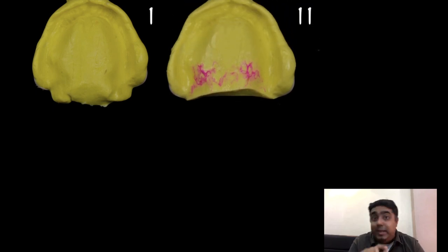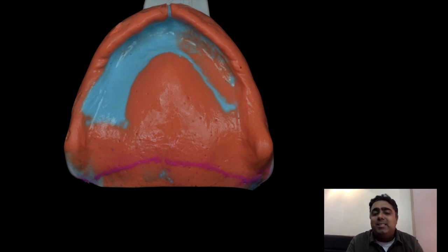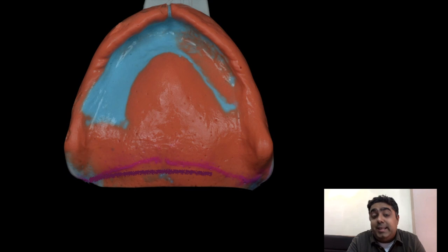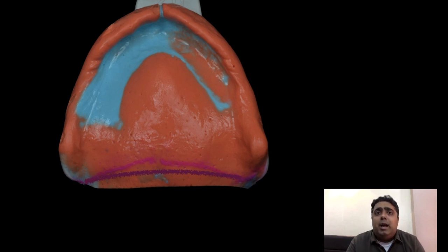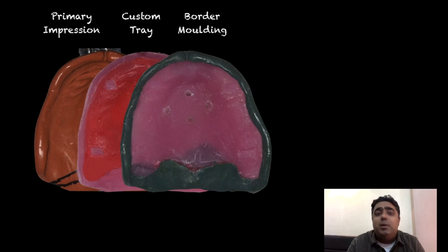Here are the steps which lead you to your first acquaintance with the same. Markers used intraorally may look smudged on the primary impression and need to be carefully refined. Care should be taken to maintain the boundary of your impression a few millimeters beyond the posterior vibrating line. A common mistake is over-shortening the extent of the denture — knowledge of palatal anatomy is essential. In a flatter palate, one would expect a more posterior extent; a mistake here can make the patient devoid of full retention. Let's look at the flow in various stages: starting with the primary impression where the PPS is marked, to the acrylic custom tray where the PPS region is inherently made more compressible towards the tissues.